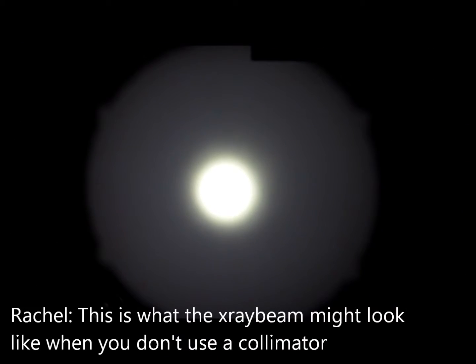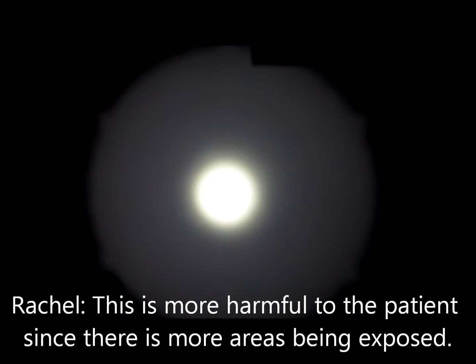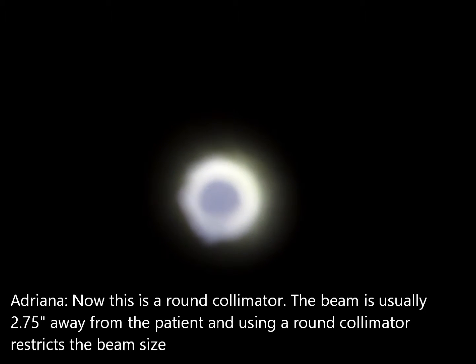This is what the X-ray beam might look like when you don't use a collimator. The beam is divergent and it's not restricted at all. This is more harmful to the patient, and there's more area being exposed. Now this is a round collimator. The beam is usually 2.75 inches from the patient, and using a round collimator restricts the beam size.